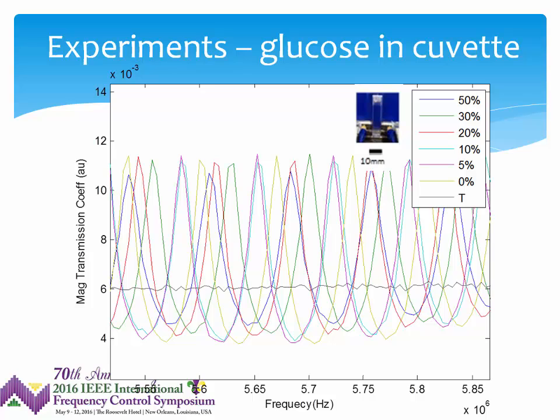Okay, so in fact, the prototype devices were constructed with off-the-shelf transducers, which had lower operating frequencies, so we had to scale up the dimensions a little bit. And these were measurements that were initially done in larger cuvettes to show that they aligned reasonably with the predictions from the analytical models, so that if you change the concentrations, you could, of course, shift the associated resonances.